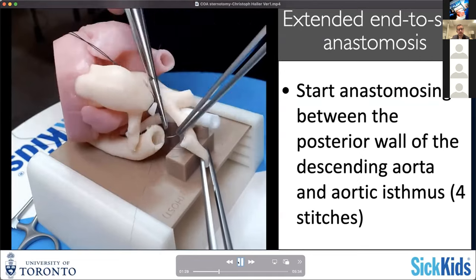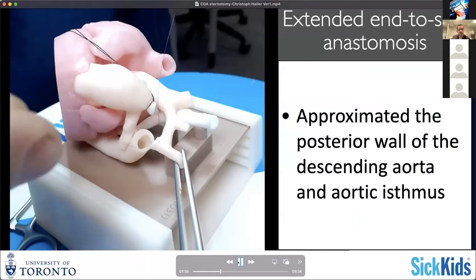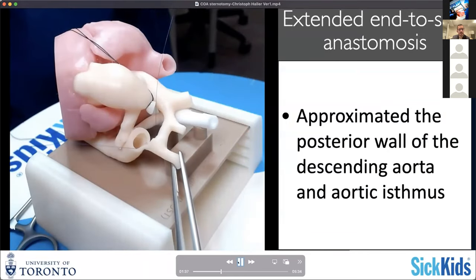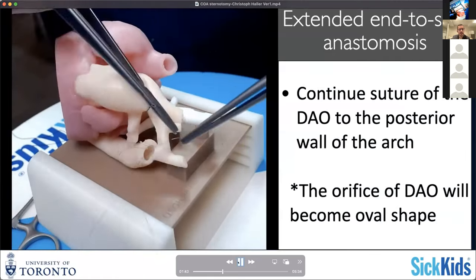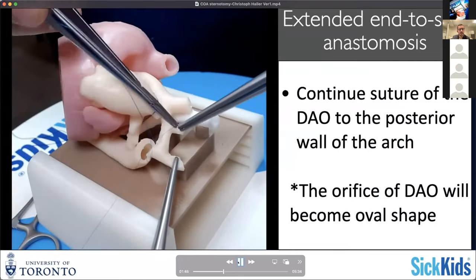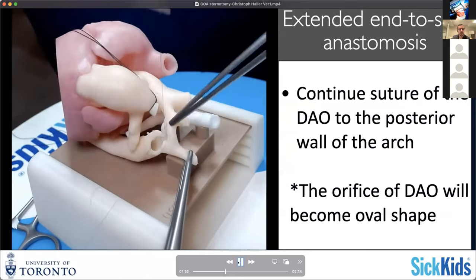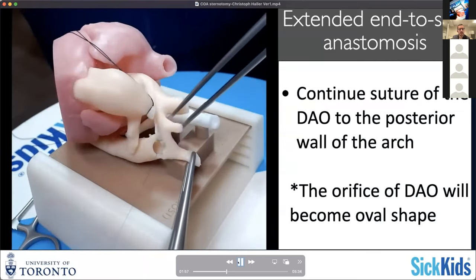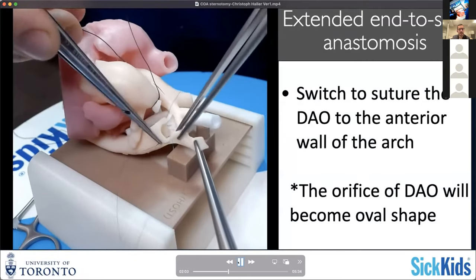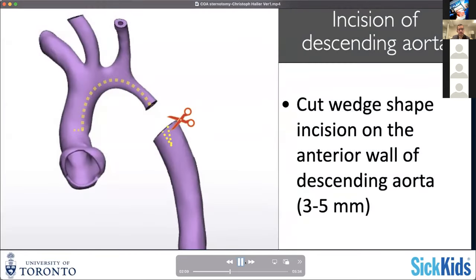You're anastomosing basically the posterior wall of your descending aorta and the posterior wall of your transverse arch. I usually run this posterior suture line quite a bit into the transverse arch so that it almost flattens out the descending aorta to some extent. We'll do a similar additional incision in the descending aorta at a later stage that allows us to augment the descending aorta further, and here just to get around the posterior circumference.